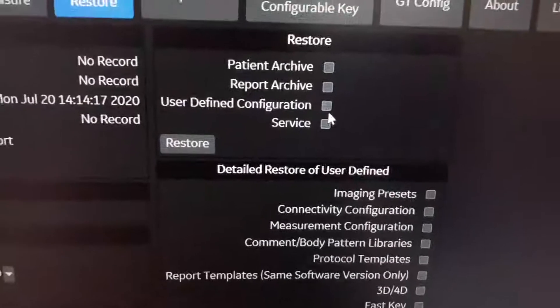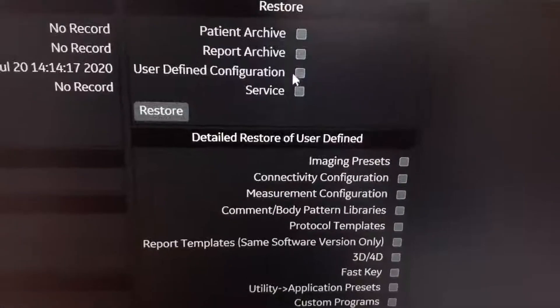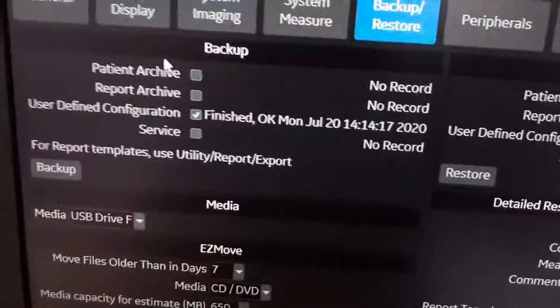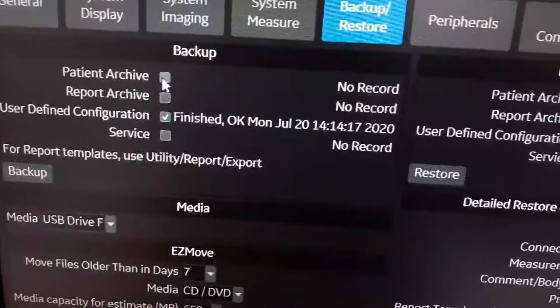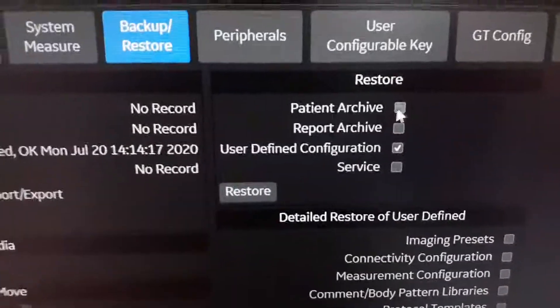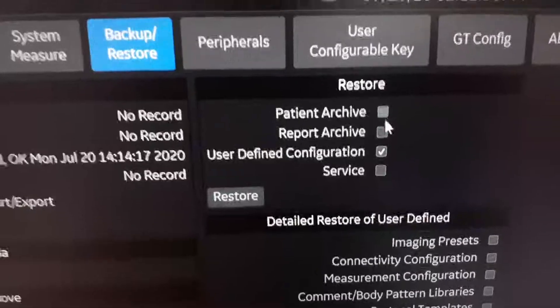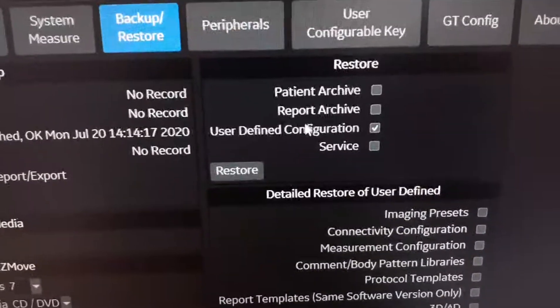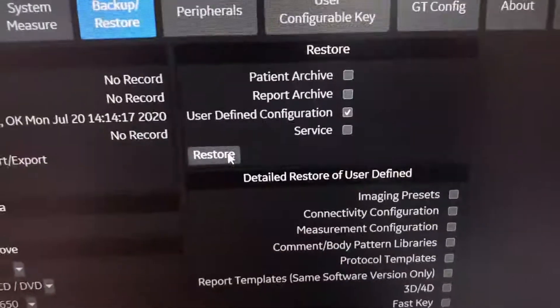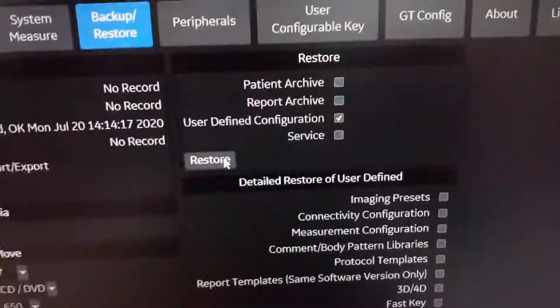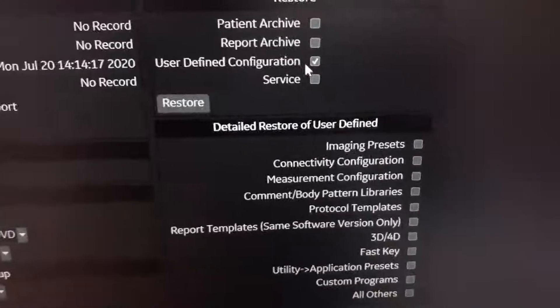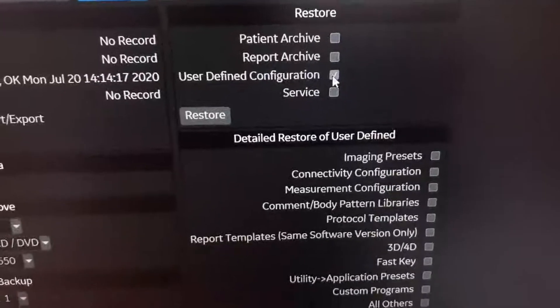To restore, press on user configurations. If you also backed up a patient archive and report archive, you should select patient and report here to restore them as well. After choosing user-defined configuration, you can press Restore to restore all user-defined configurations.